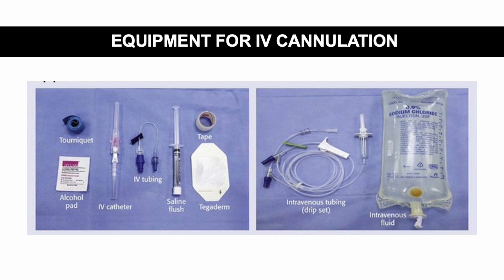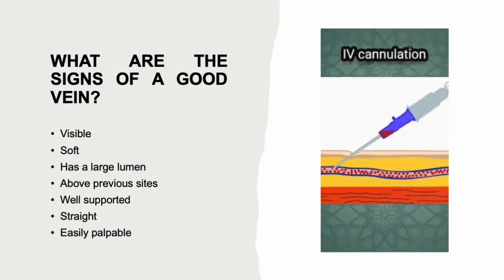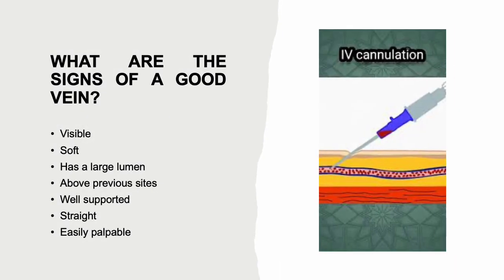This is equipment for IV cannulation. What are the signs of a good vein? Visible, soft, has a large lumen, above previous sites, well supported, straight, and easily palpable.